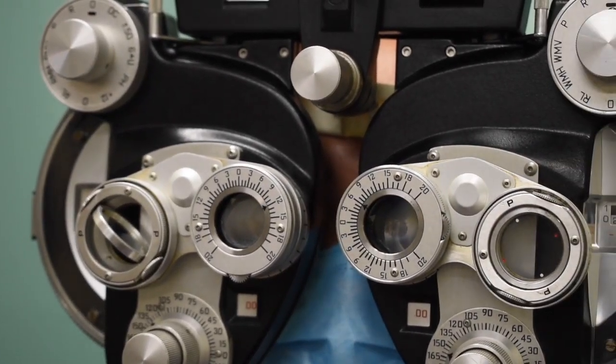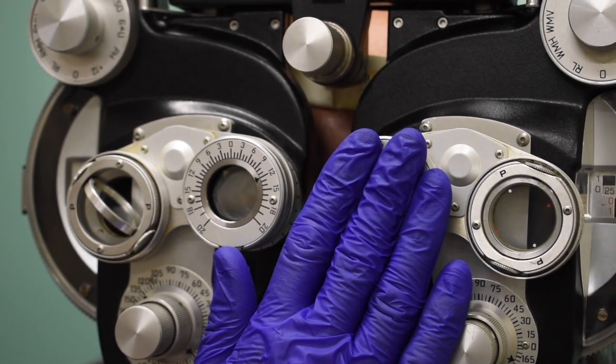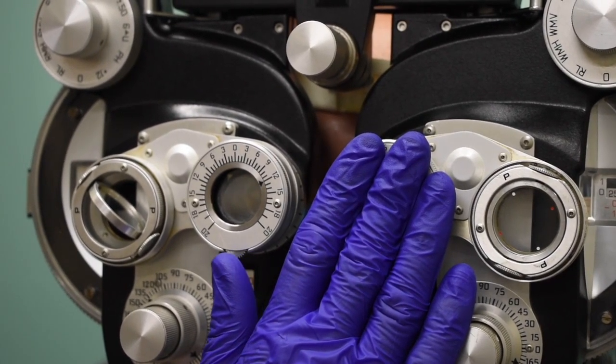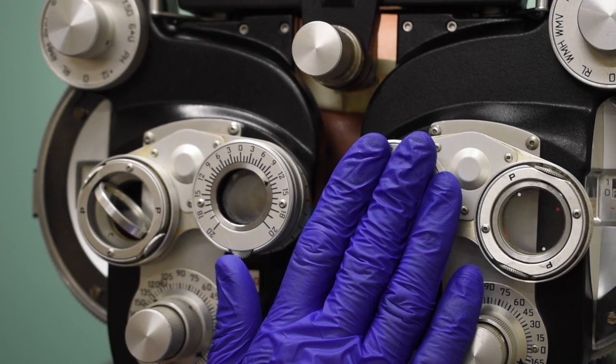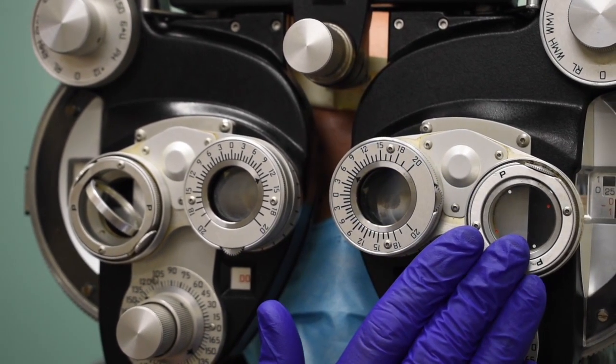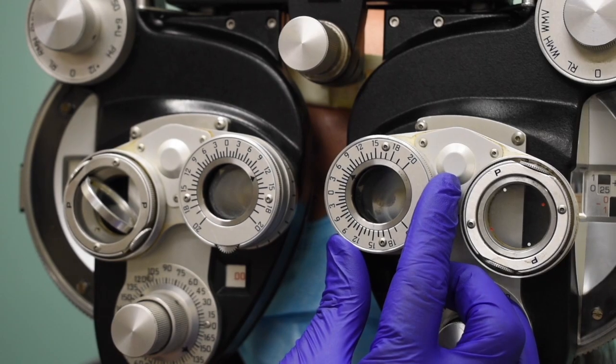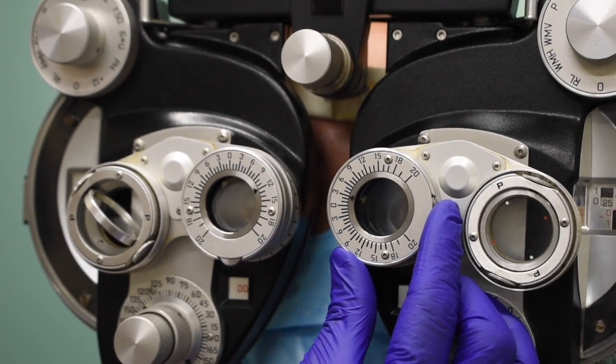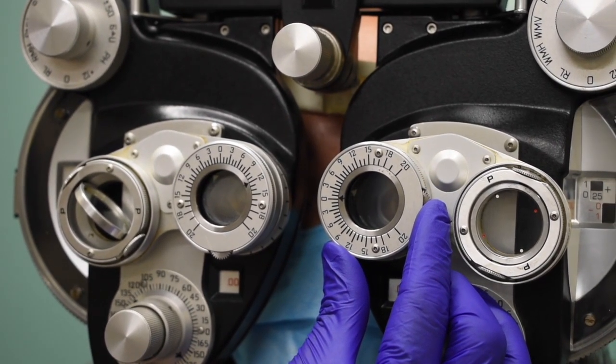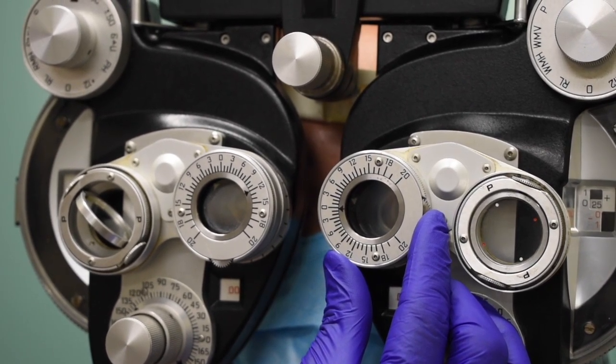Go ahead and open. Do you see two charts, two letters? Yes. When I cover this one, which one disappears? Bottom left. Great. I want you to stay focused on that one right there for me, Phoebe. Keep it as clear as you can. Tell me when this one comes right up beside it and they line up like headlights on a car. Here we go.